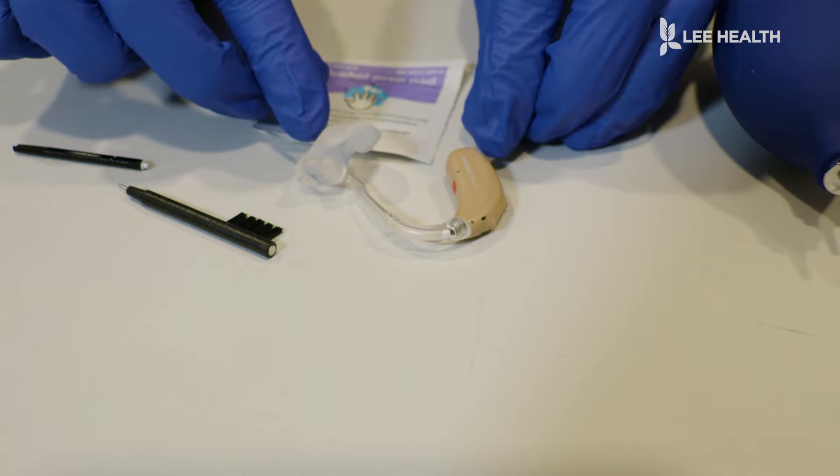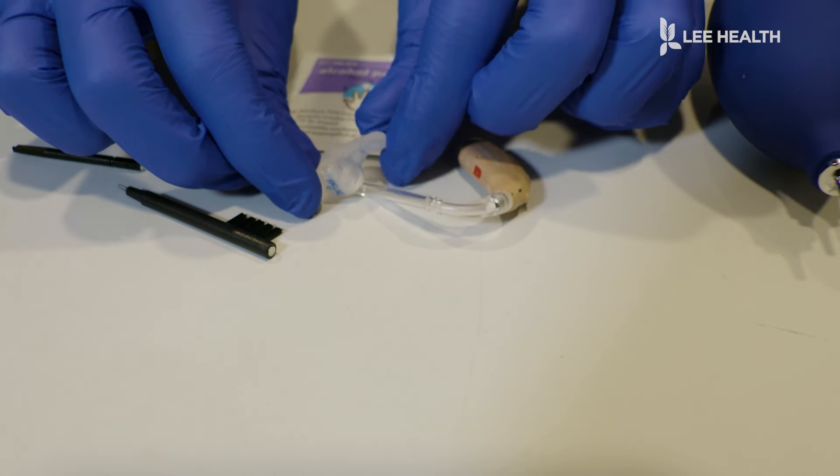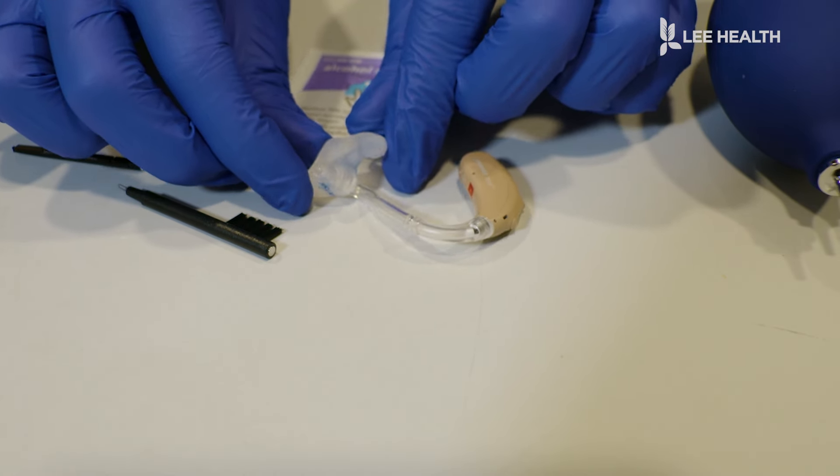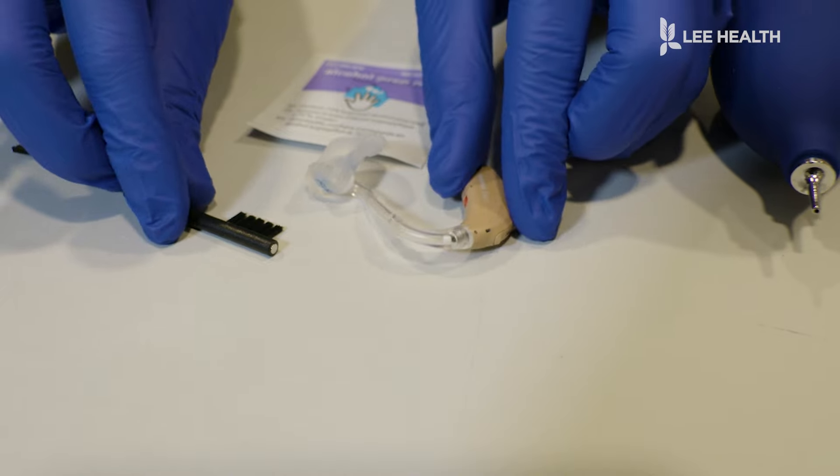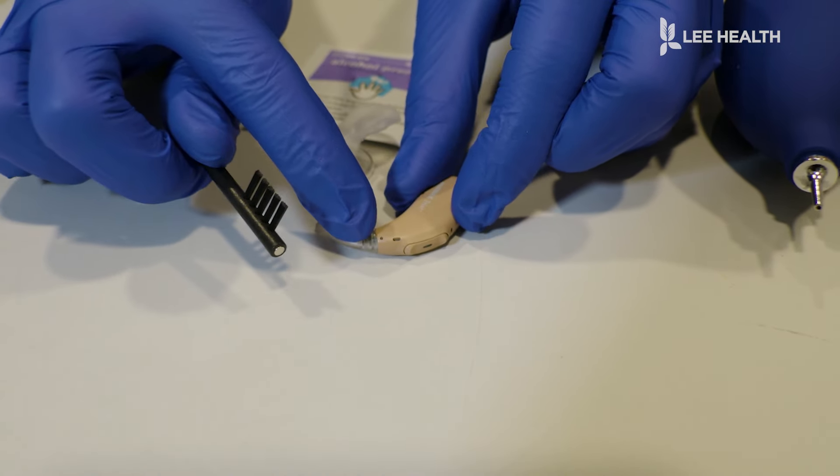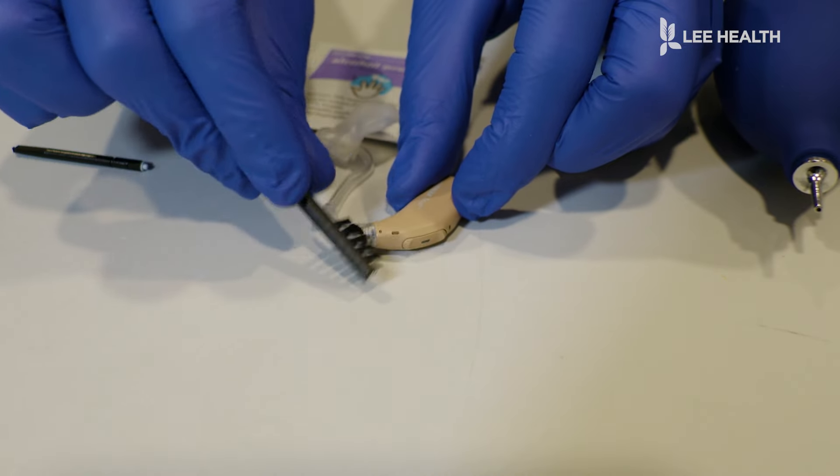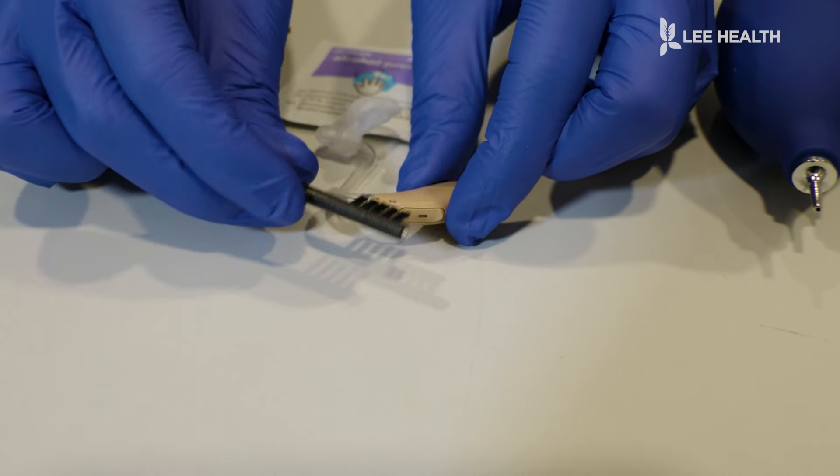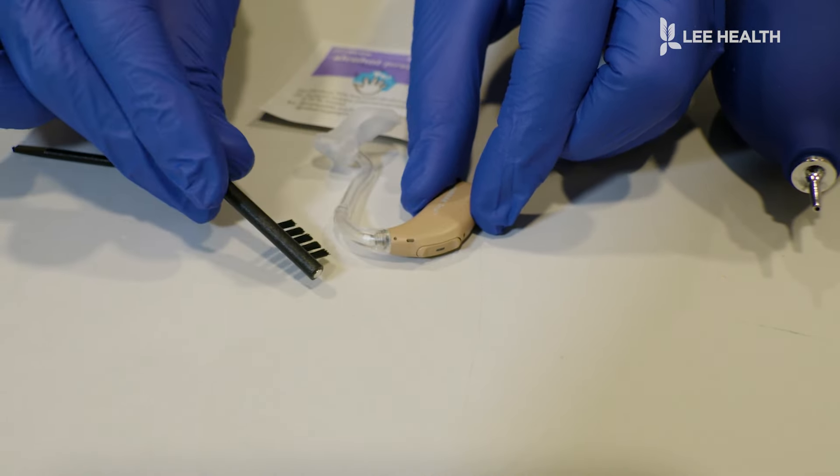For these more custom hearing aids, the behind-the-ear with the custom piece, either silicone and acrylic, we're going to go through how to clean that. First, I always take this little brush, and I just brush off these small holes and openings at the top of the hearing aid. Those are the microphone holes where the sound goes in, so you want to make sure that those stay nice and free from any debris.